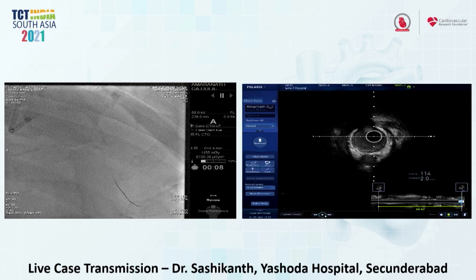Yes, we did discuss this option too. We did it sometimes with the IVUS catheter in the circumflex and stent the ostial LAD, but this we felt was probably getting it more accurate, seeing it from the same vessel rather than from the side branch, with the NC balloon 3x12. I agree with accuracy, but when you're sacrificing safety at the expense of accuracy, then you perhaps take the other option.